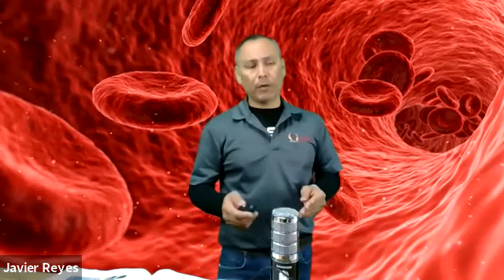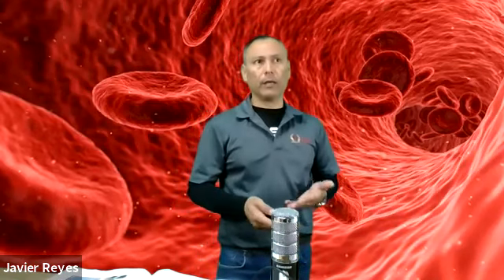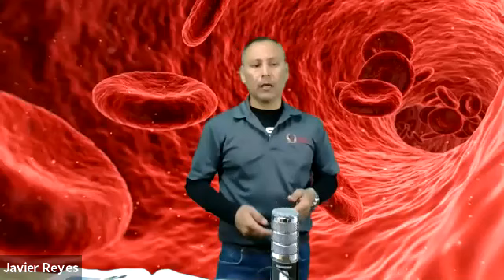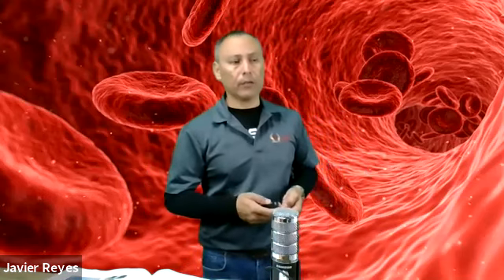Always open every package in front of the patient, in front of the caregiver, the guardian, so they can see that you are using brand new sterile equipment. It just gives them that reassurance that you're using proper equipment. Step 10, puncture the site and discard the lancet. You know that these lancets are single use only. You cannot reuse them even if you try, because of the permanent retraction of the needle or blade. That is an OSHA requirement.